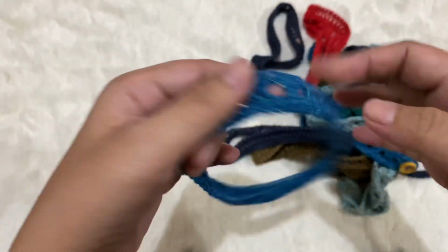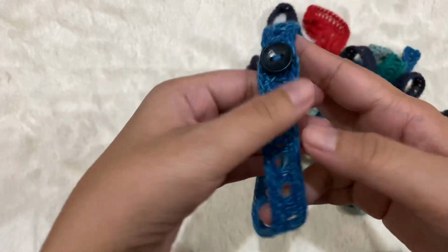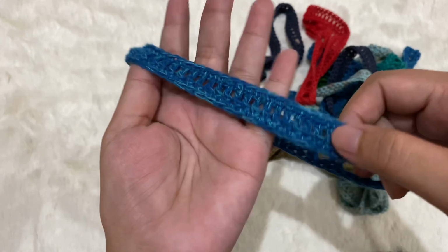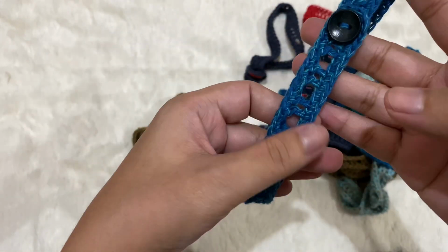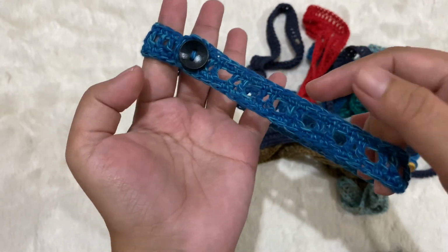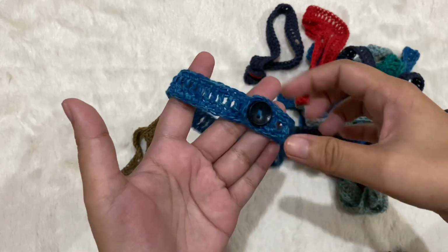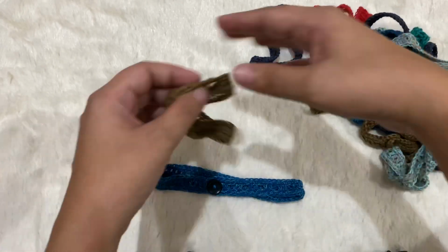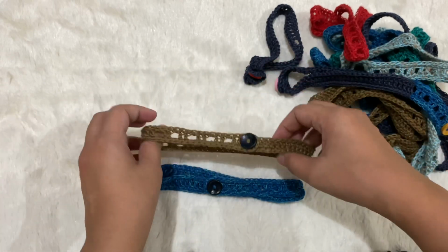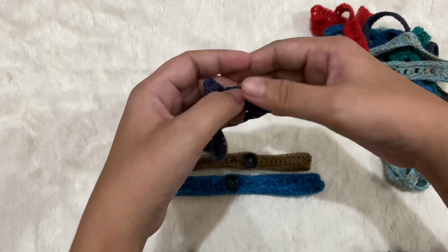Hello everyone, today we will be making this easy one button adjustable crochet ear savers or face mask adapter. Okay, so this one is like a belt type ear saver that has notches to help you adjust the length of the ear savers. Here I have made already a few and I'm planning to make more to be donated to nearby hospitals.